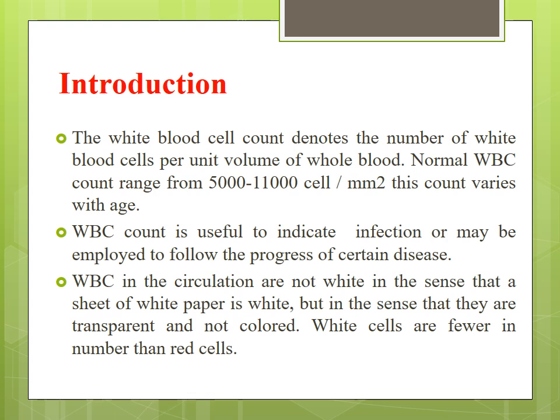Students, what is the aim of counting WBC? I count WBC to find out whether it is within the normal range, or whether I have an increase or decrease in the number of white cells. This is because many diseases can affect the number of white cells, which may increase or decrease.